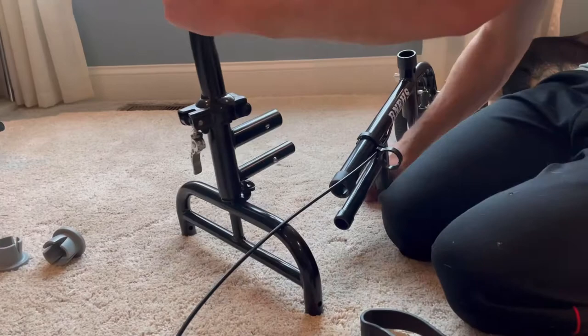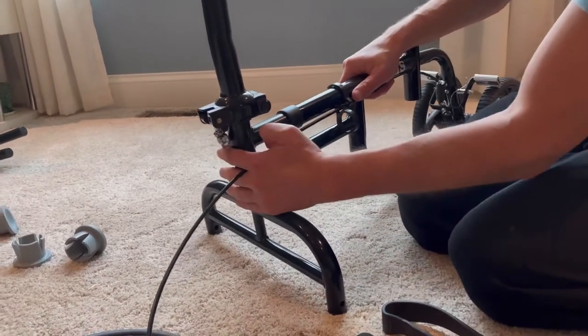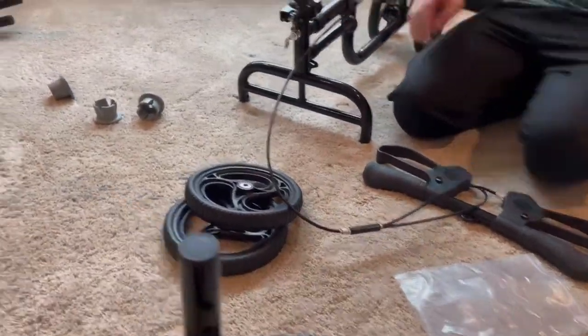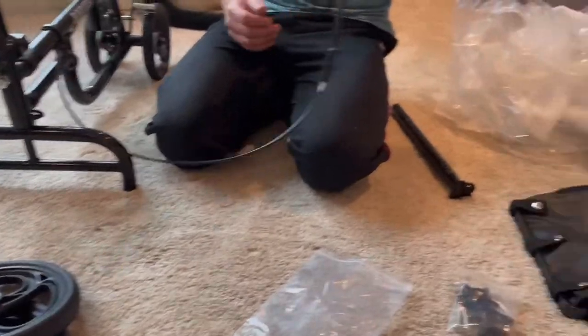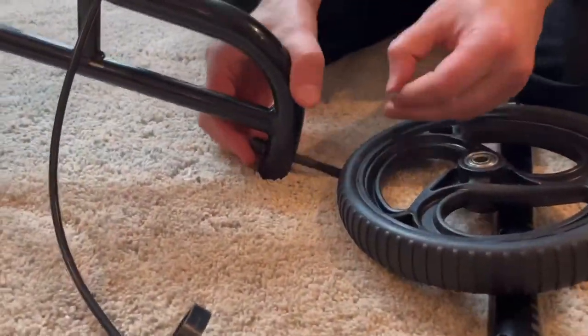This walker is super easy to put together, and it's really easy to travel around with as it folds up as well. Let's go ahead and watch the video, and I will explain how it gets set up and all the fun features that you're going to receive with this walker.